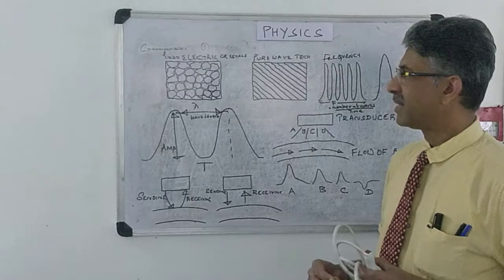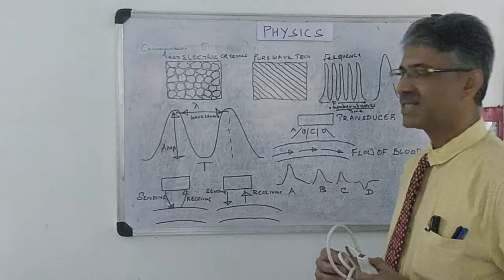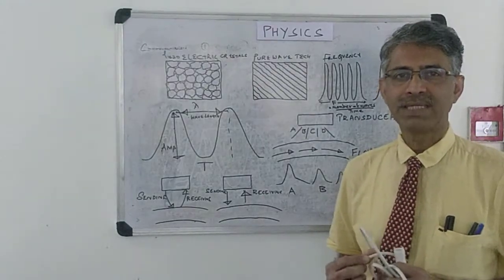Today I am teaching the physics behind the ultrasound. Physics is a very essential component before you do anything using the ultrasound machine.